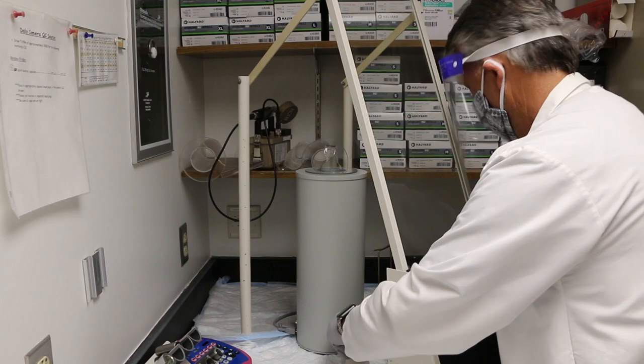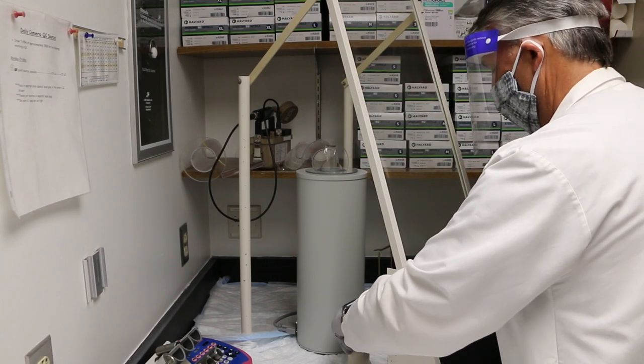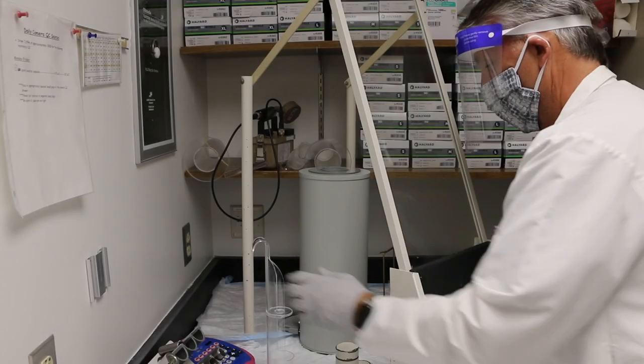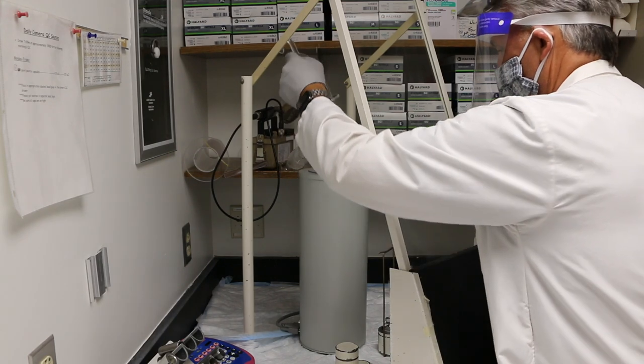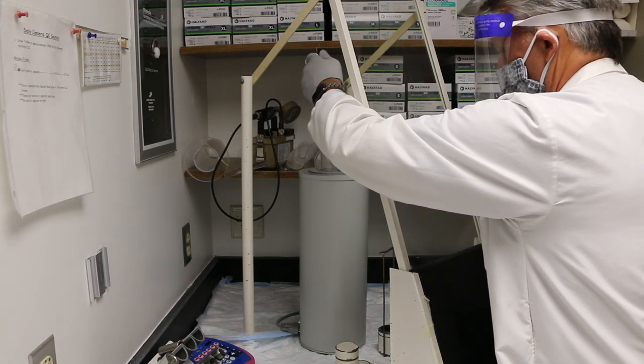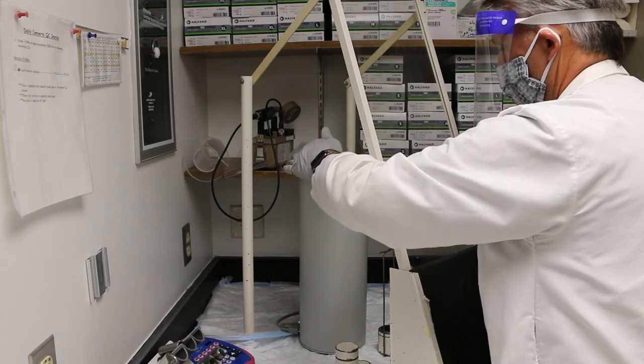Remove the lid, invert the container and lift the lead cover off so that the vial stands free. Using a pair of tongs, grasp the metal ring on the top of the vial and place it in the dipper. Then insert the dipper into the dose calibrator.